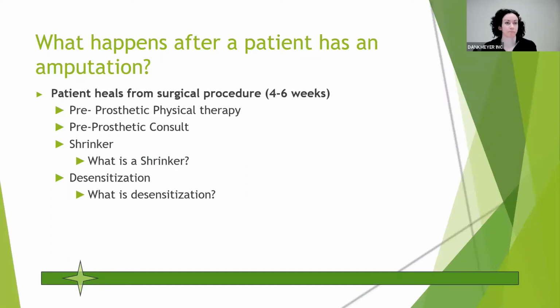Great, thanks. And then my second question, Sarah, was about the outcome measures. So I work with kids, and Rochelle joins me for our limb differences clinic once a month here. My question is about outcome measures and K levels. So the AMP isn't validated for children.